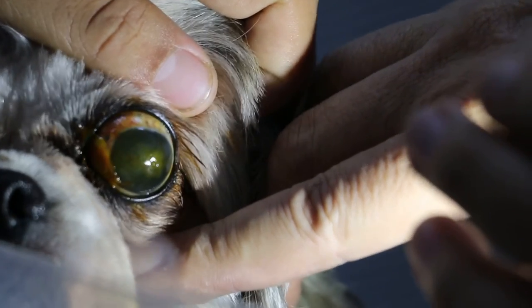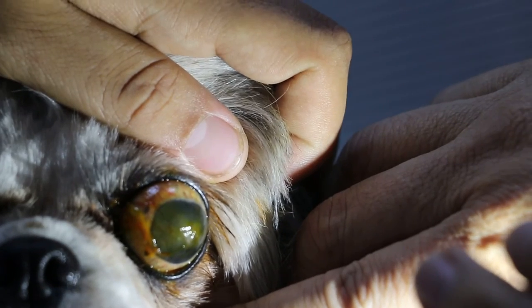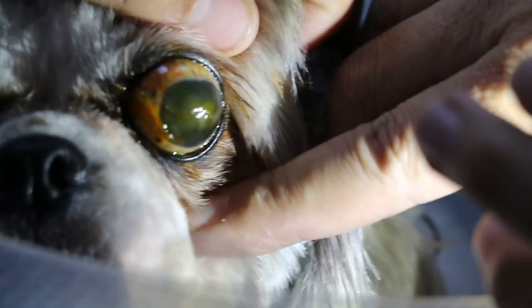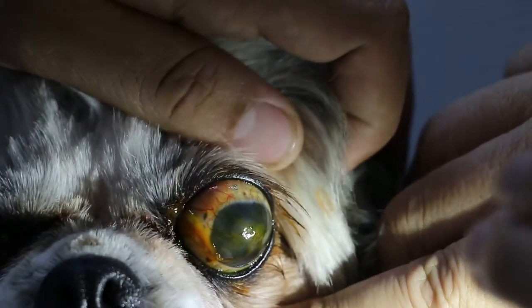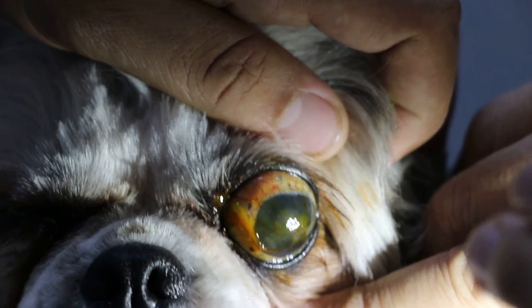You can still see the white scar and the brown color. Only the lower part is clear — 5 o'clock to 7 o'clock is clear. Then after that, 9 o'clock to 3 o'clock is scar — cloudy we call it. The cornea is scar.